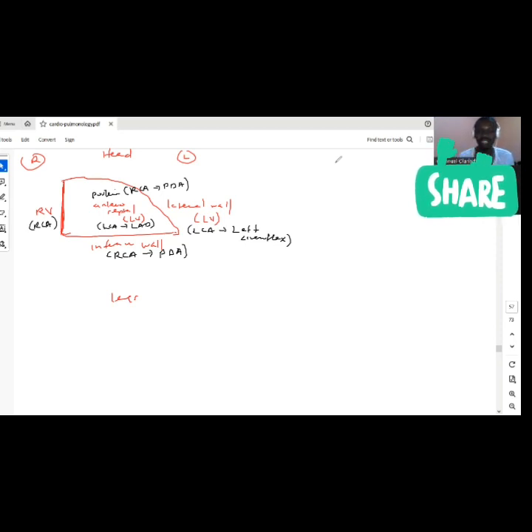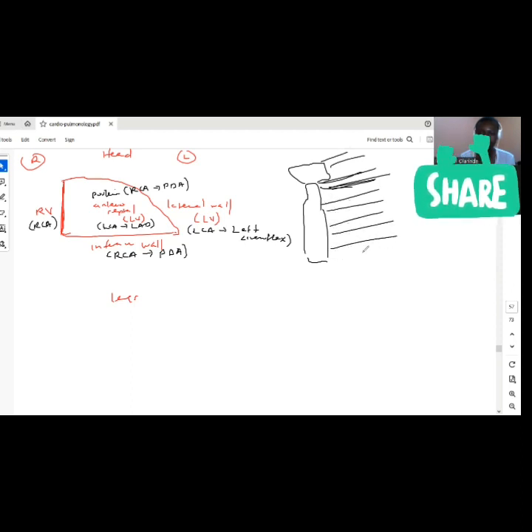So if I'm looking at somebody's chest, for instance, like this, and I have my manubrium, I have the sternum, I have the second rib coming out here, first rib usually comes up there, you have your third ribs, fourth, fifth, sixth rib.